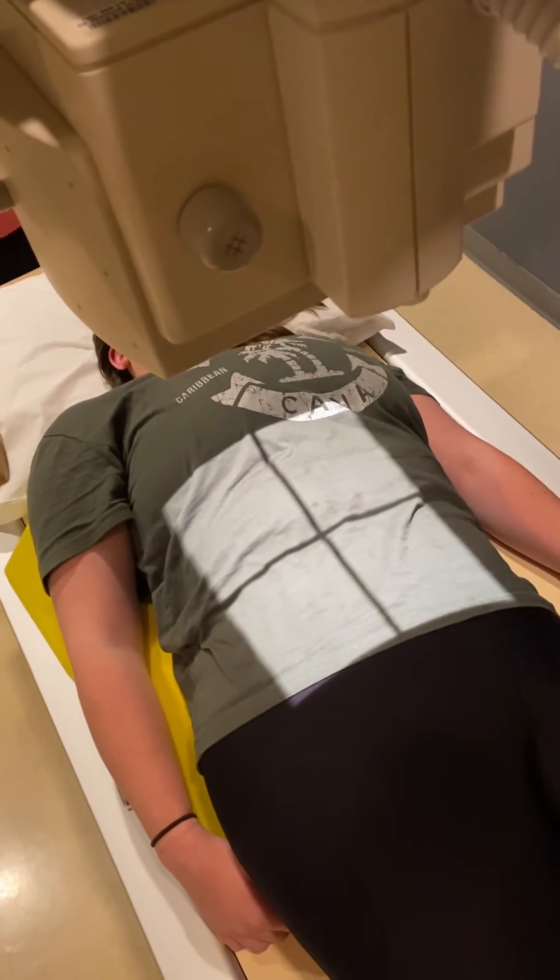You can see the hips are back further than the upper body, so can we scooch it back a little bit more? There we are. Are you okay? All right.